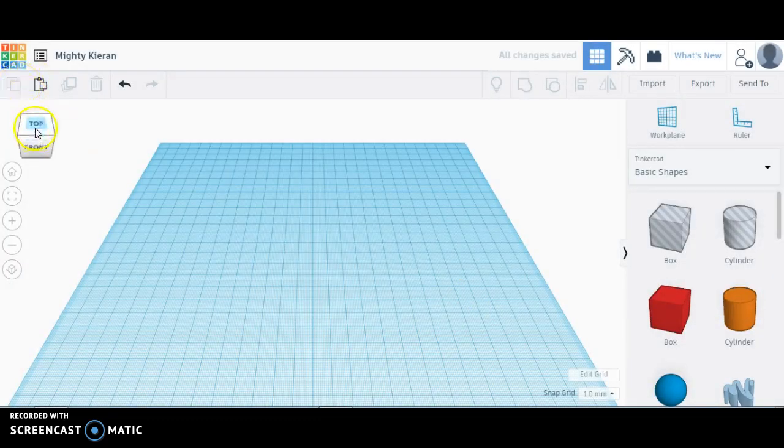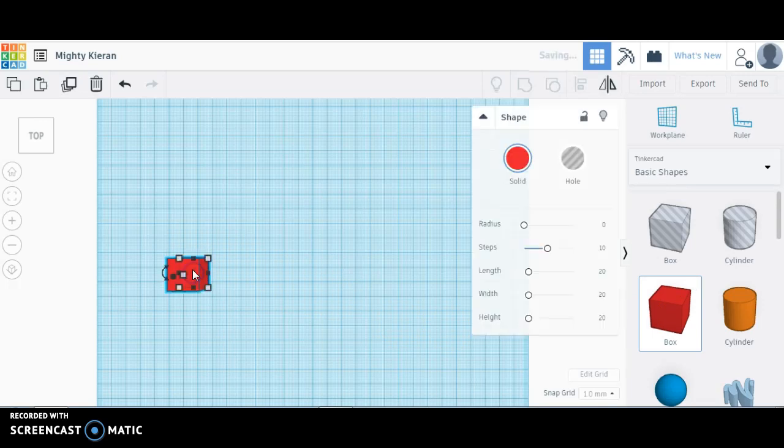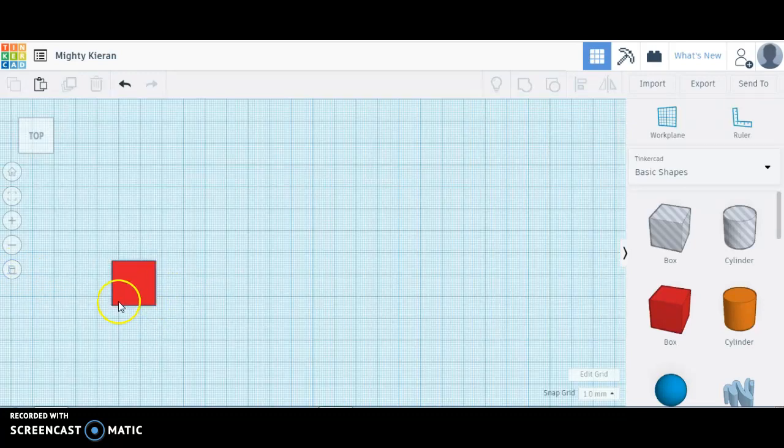I also like to work in a top view, and I like to work with a parallel projection. I'll drop this box on here to show why. So in perspective view, I see more than one side at a time. For alignments, if I switch to orthographic view, I get a parallel projection, which is better in my mind for these layouts.